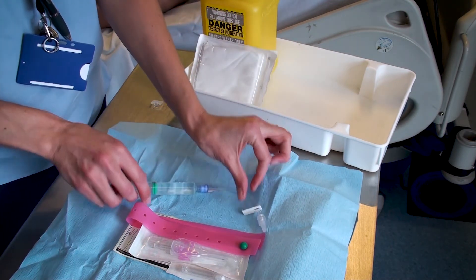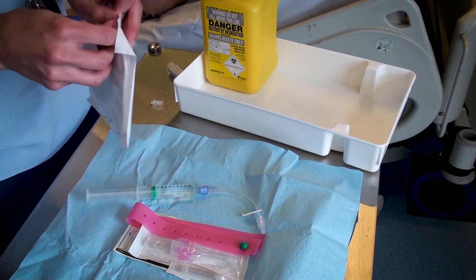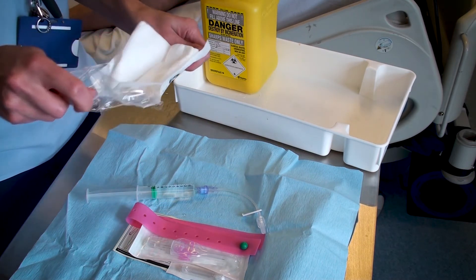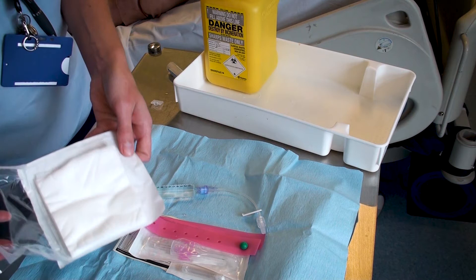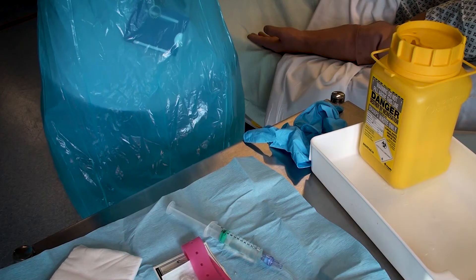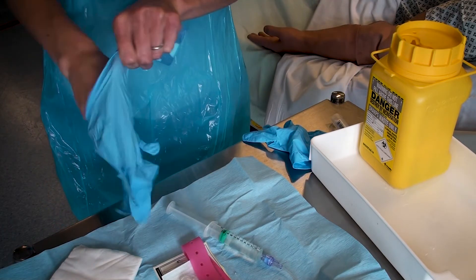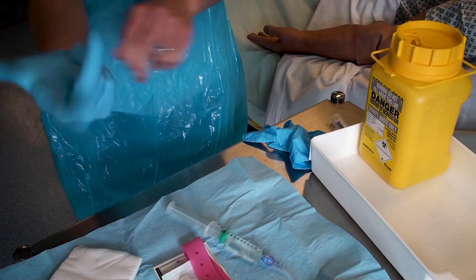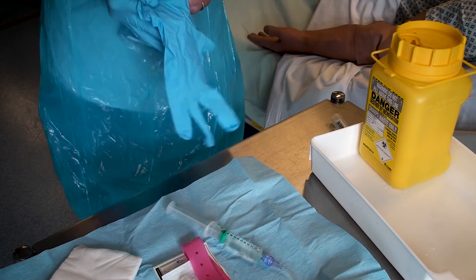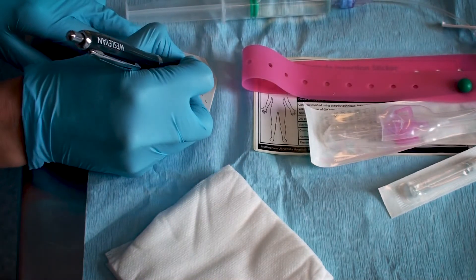If a cannulation pack is not available within your clinical area, the other disposable items can be obtained. Once the equipment is all prepared, you must gel your hands before applying an apron and non-sterile gloves. On the label, you must record the date and time the cannula has been inserted.